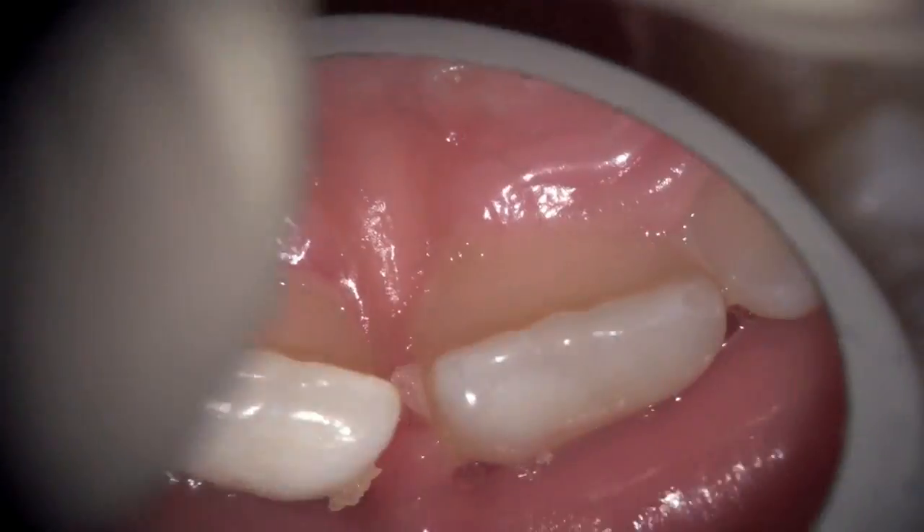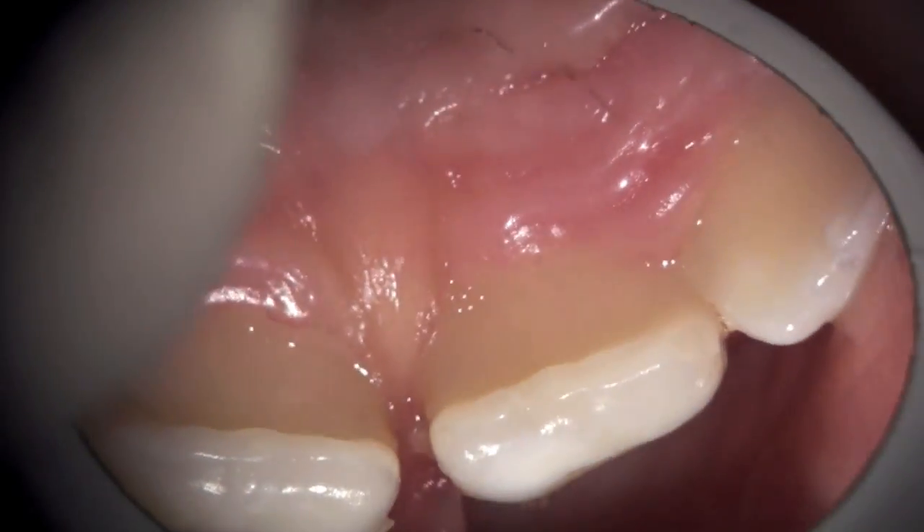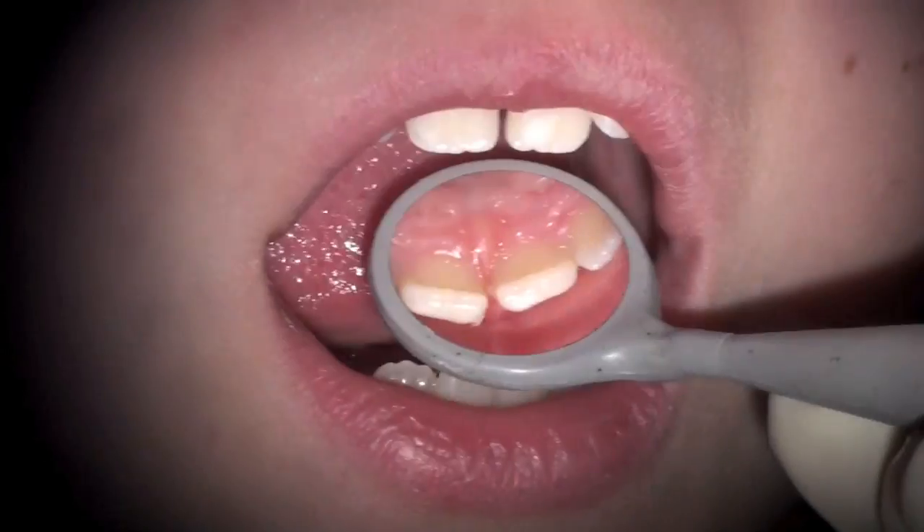you'll see blanching in the palatal area here. You can see that the frenum is very thick — it goes right through from buccal to lingual. You can see as they pull, it's not only moving but blanching in between, causing a diastema.